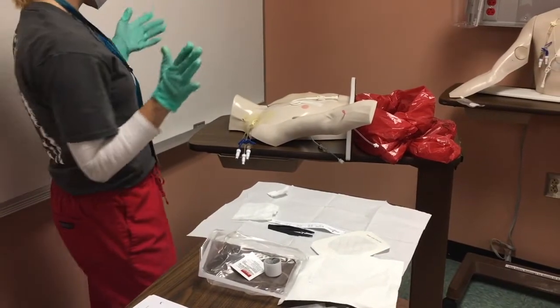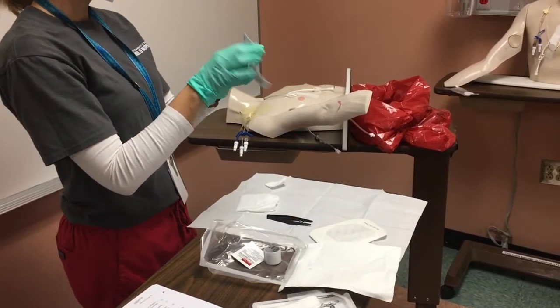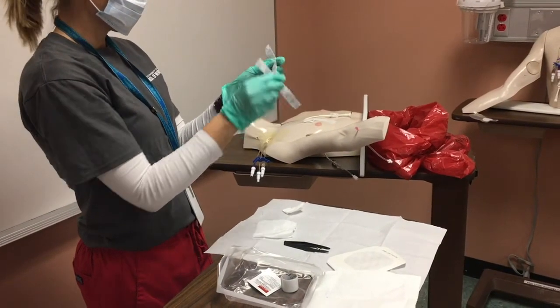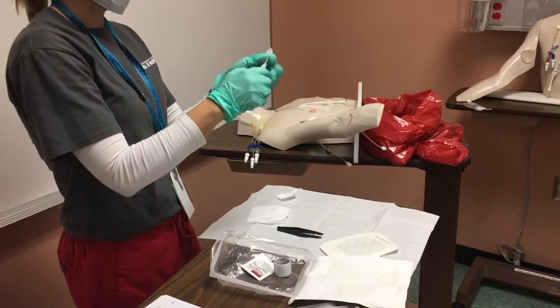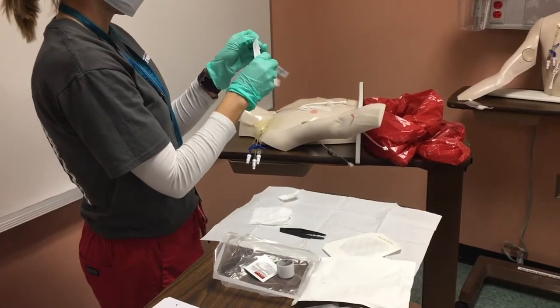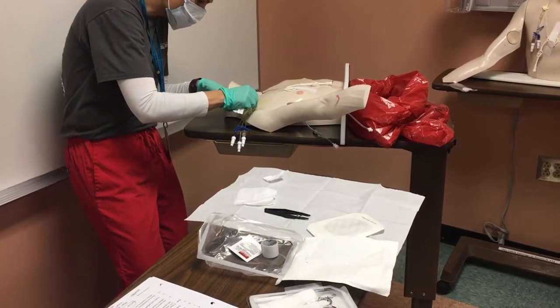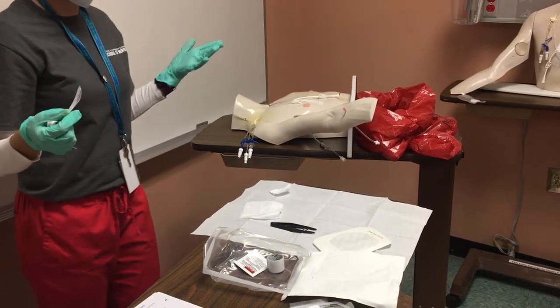Once that's dry, I'm going to take the measuring tape — it's in centimeters. A lot of times the measurement is on the inside. Keep it bunched up in your hands so it's not flailing around — I fold at the zero. I'm going to measure from the insertion site at zero. I'll say it's about three and a half centimeters — I'm going to remember that for documentation.